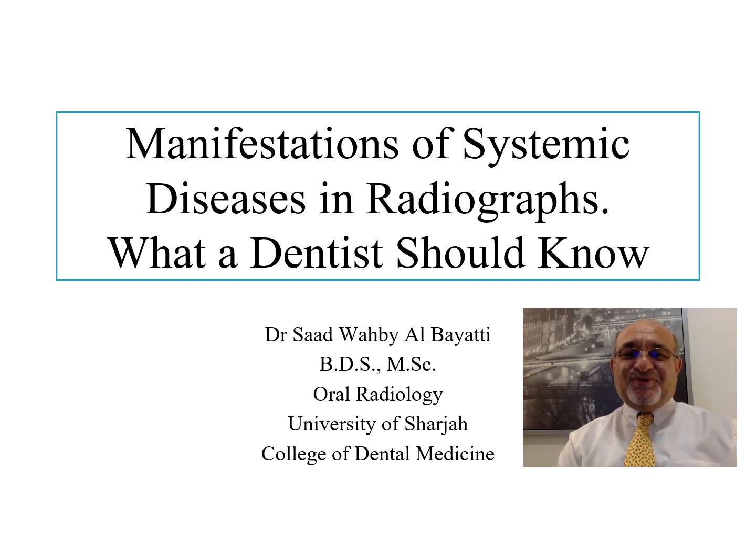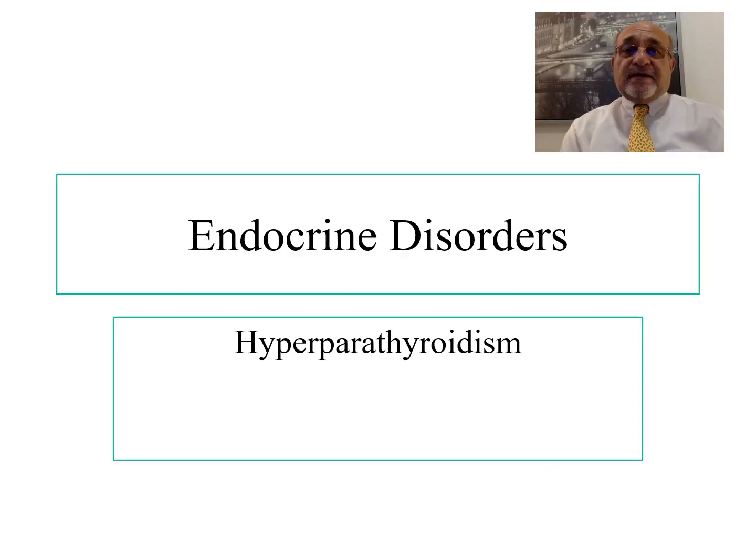Welcome everybody to a new presentation in a series of presentations discussing the role of dentists in diagnosing systemic diseases from the intraoral radiographs. Today in our presentation, we will be discussing the endocrine disorders, and in particular, we will be discussing hyperparathyroidism.